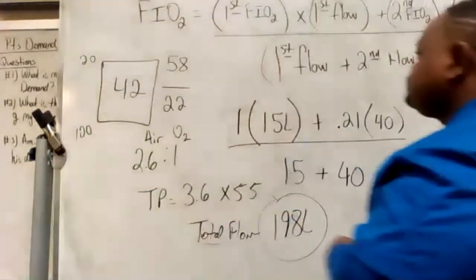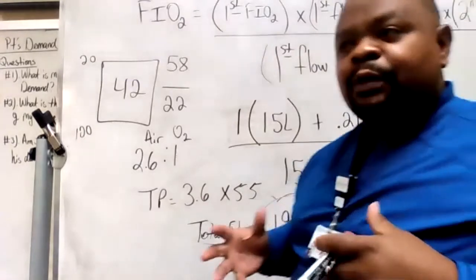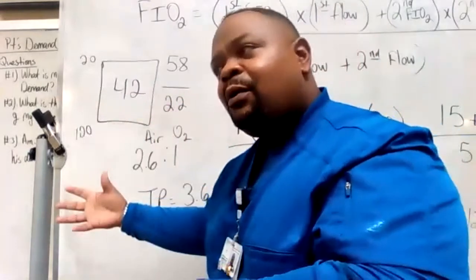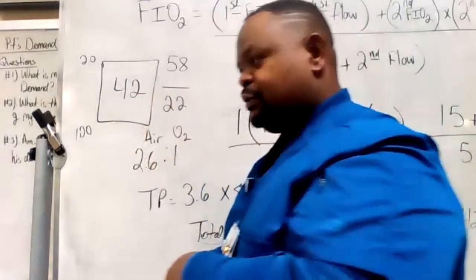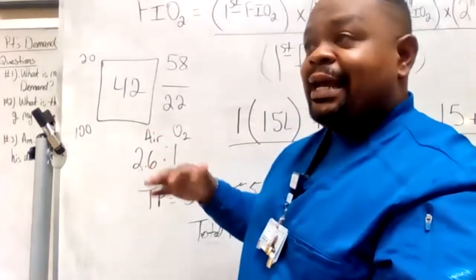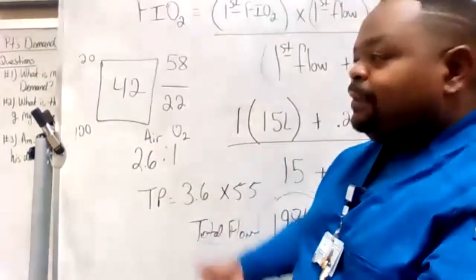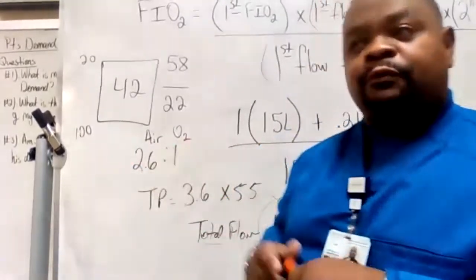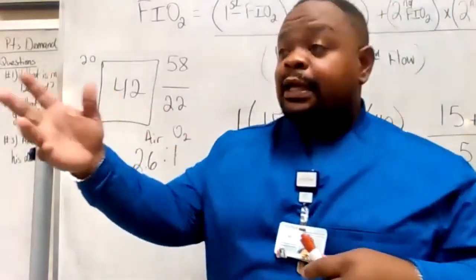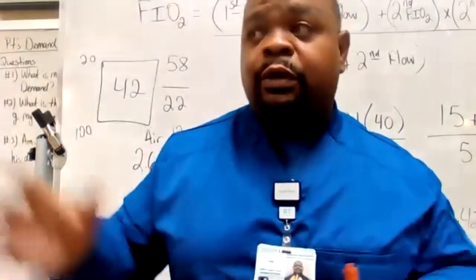All right. So that's how I figure out the tandem. That's called a tandem when I have to use two, because this patient might need more flow and more FiO2. Usually we can do like 50 liters per minute, 60 liters per minute, and that's on 28%. But now with a tandem, I can bump up the FiO2 and the total flow because I'm using two separate systems.